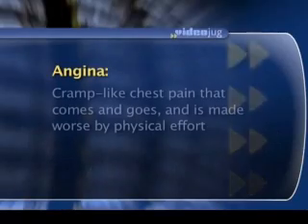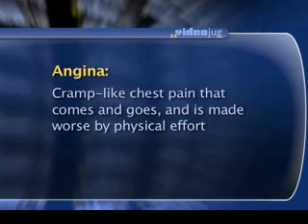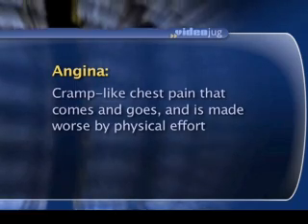On the treadmill, they may get tired because they're running, for example, or they're doing exercise. And of course, if they have coronary disease, they may get their usual chest pain or angina with increasing cardiac workload during the procedure. That is really not specific to nuclear medicine, but it's a side issue in relation to the stress that the patient is undergoing for us to appropriately perform the protocol.